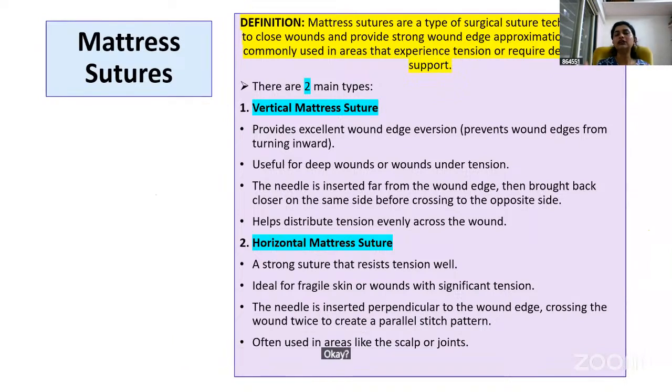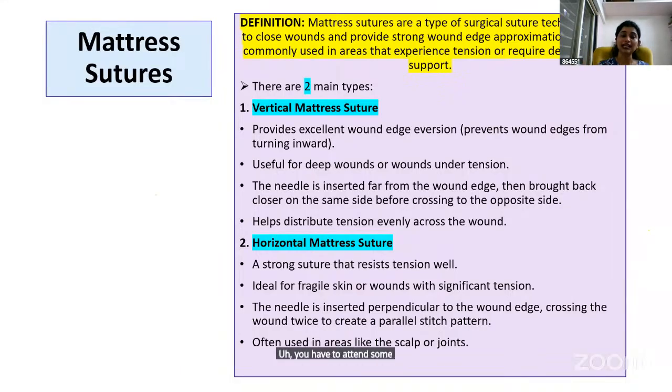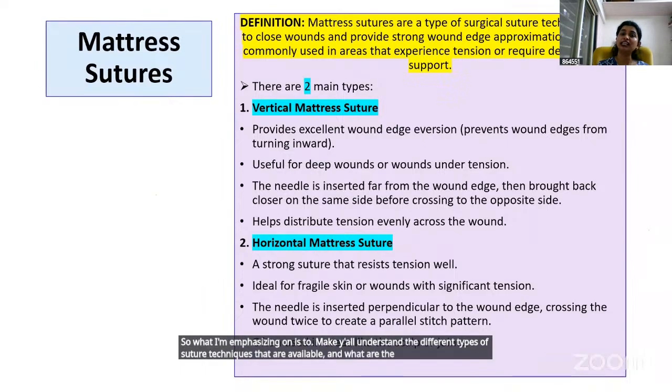Okay. So now it is very difficult to explain the technique when merely describing it. You have to see the videos, or you have to attend some hands-on sessions to understand the techniques. So what I'm emphasizing is to make you all understand the different types of suture techniques that are available and what their specialities are, or where they are commonly used.